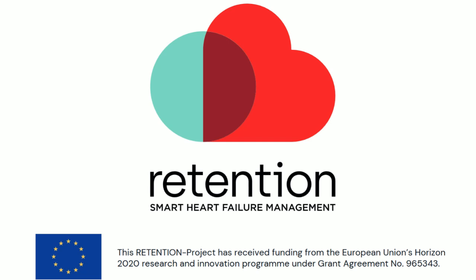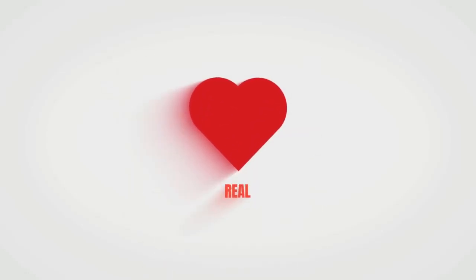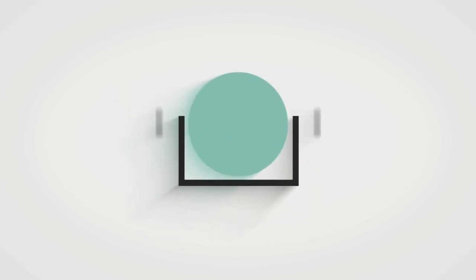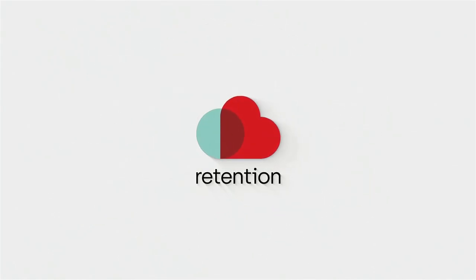Welcome to the demo of Retention, a groundbreaking EU-funded real-world data and AI-based digital health platform designed to transform care for patients with advanced heart failure. Retention helps clinicians deliver safer, more personalized care, reducing hospitalizations and improving quality of life. Let's take a look at how Retention is shaping the future of cardiac care.